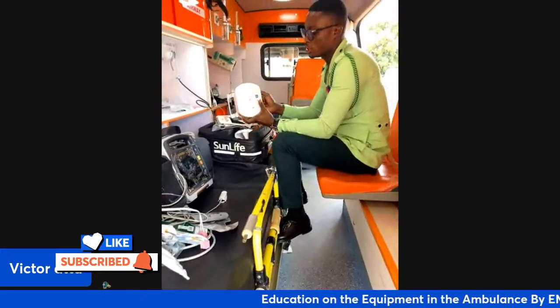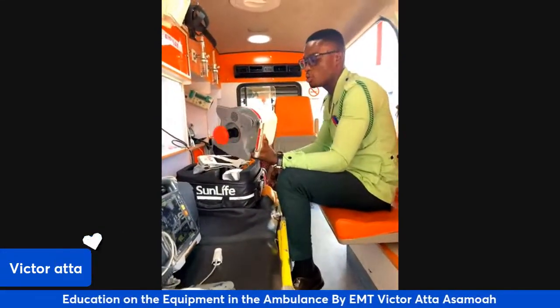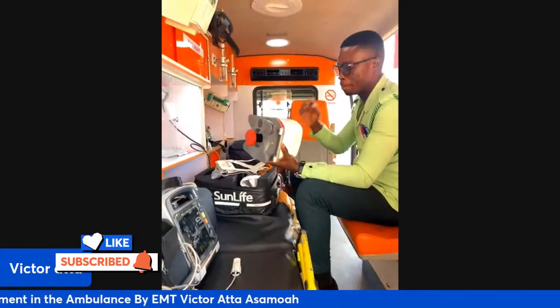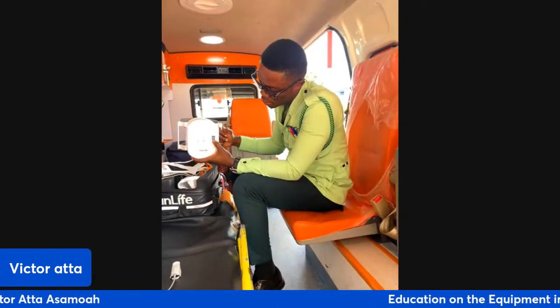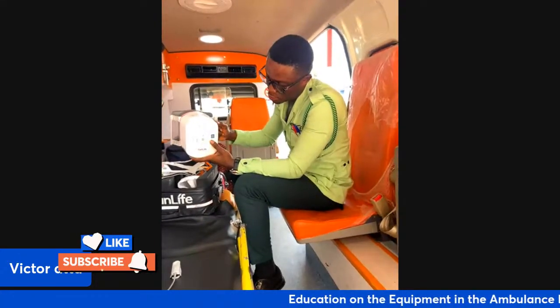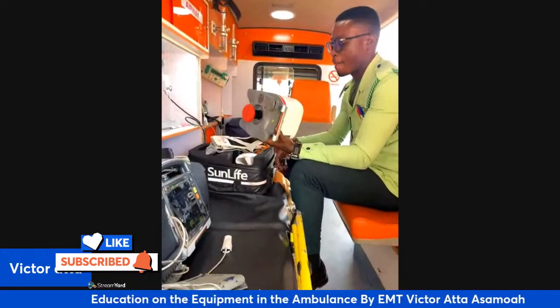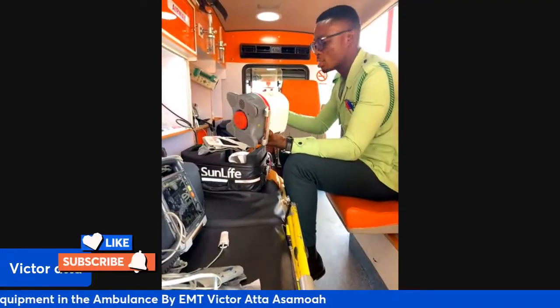So 30 chest compressions, 2 rescue breaths. When it reaches 30, you deliver the rescue breaths. When you place it on continuous and play it, it goes directly and gives the compressions continuously.